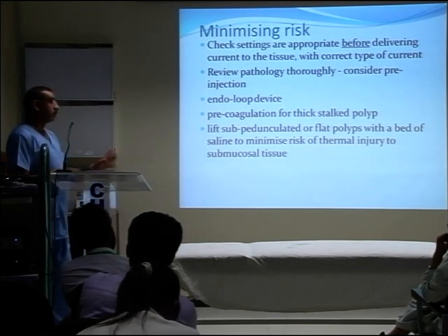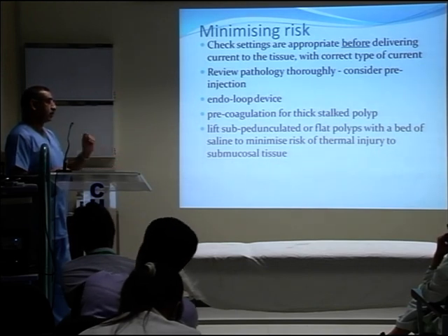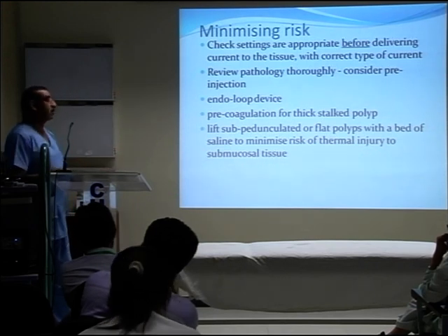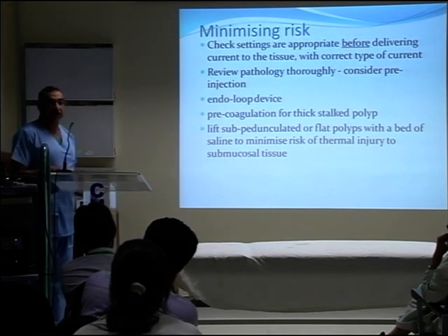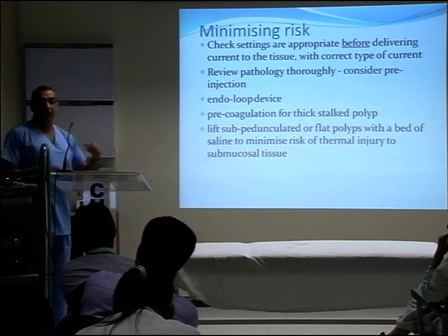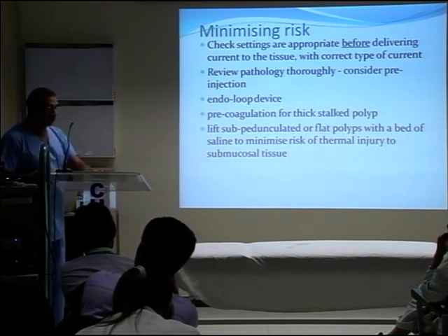And leave it for at least 15 to 20 minutes, because in one case I was just doing a flexible sigmoidoscopy. So I did it, came out, went to the coffee room, had a cup of coffee, had a bit of a chat, and then went back in again. But if you are doing a complete colonoscopy, then complete your colonoscopy, come back, and it would have shrunk. Because if you go in too quickly, it wouldn't have shrunk. It will still act as a hemostatic agent.